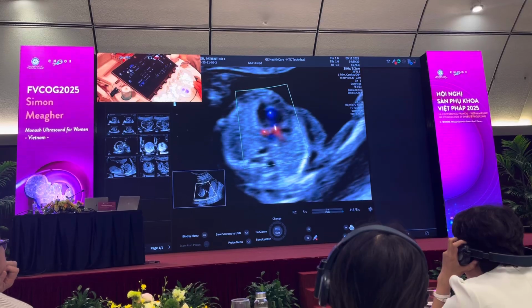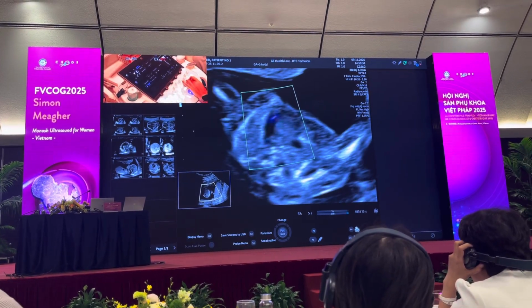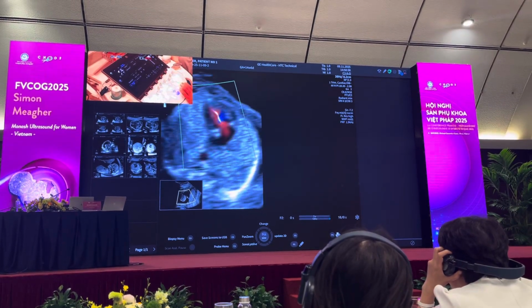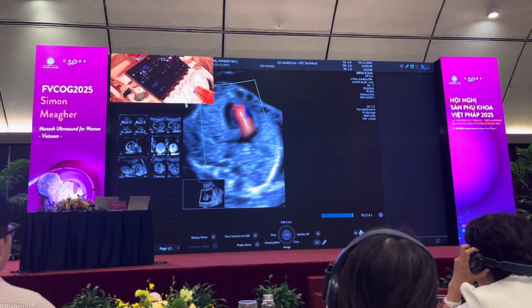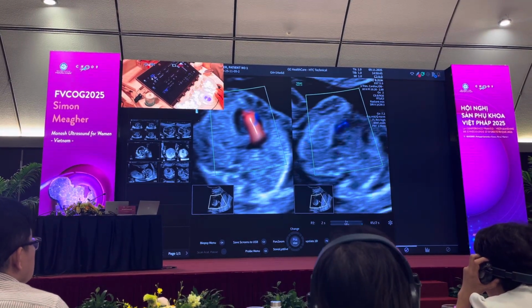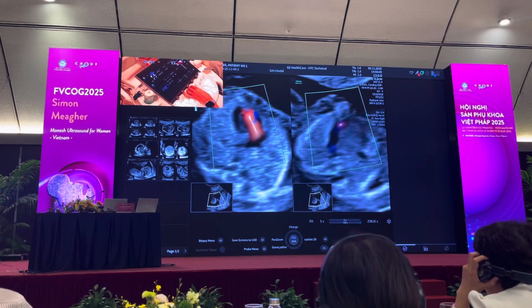And when I sweep up the right cardiac ventricle, I see there's a single artery. So it's important for me to split my screen in 2, to magnify the image, see a single ventricular fill with no fill of the left ventricle, and then to sweep up here and I can see a single vessel coming out of the right ventricle.